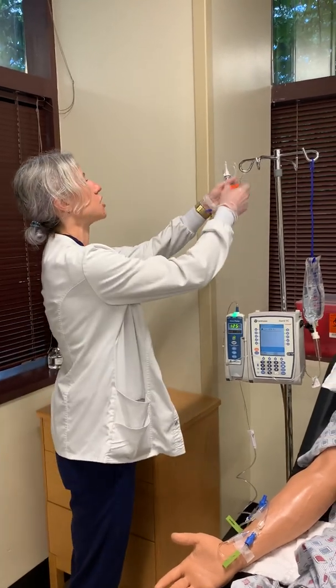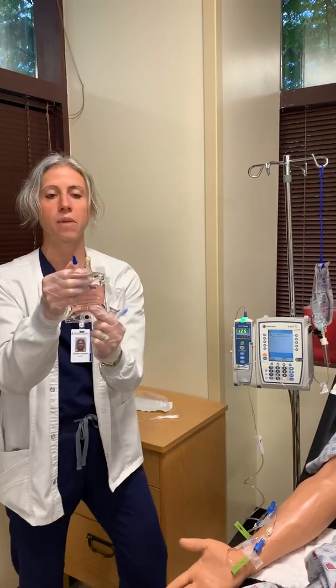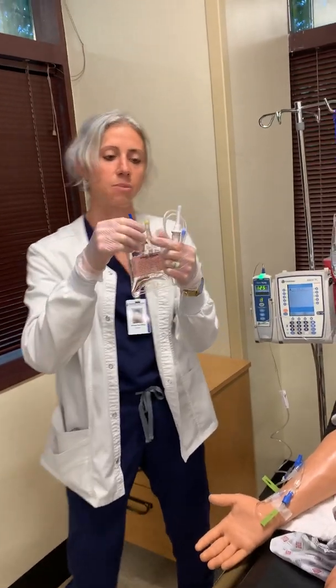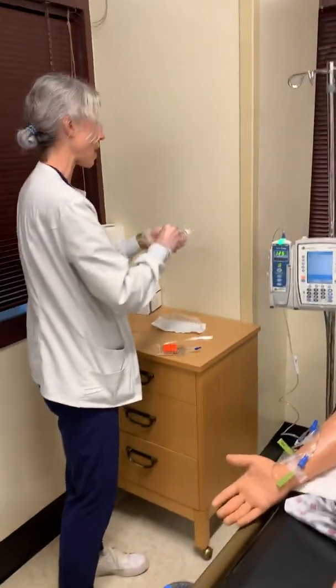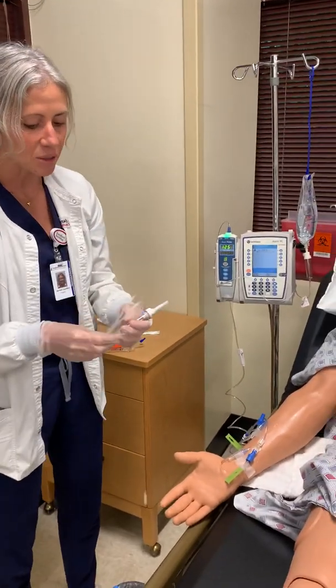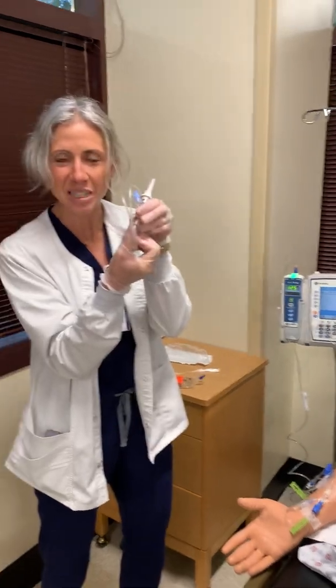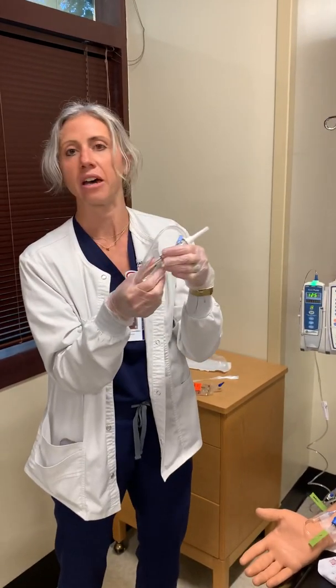You may have talked about this, so I don't want to regurgitate a lot of it, but as a rule of thumb, this is the part where a needle goes through, which you're not going to be using, okay? This is where we're gonna take the cap off so that we can go ahead and get this primed. I always, always, always close it first, okay? Why do we do that?